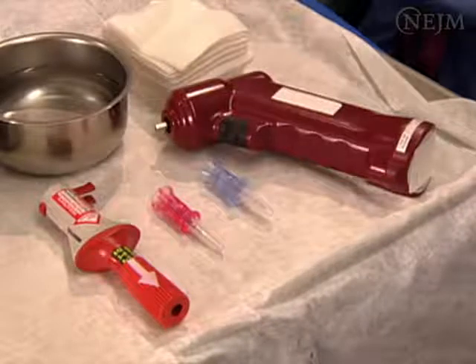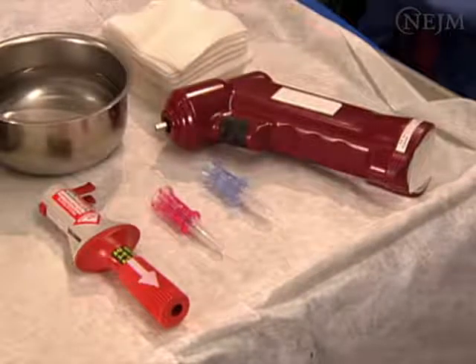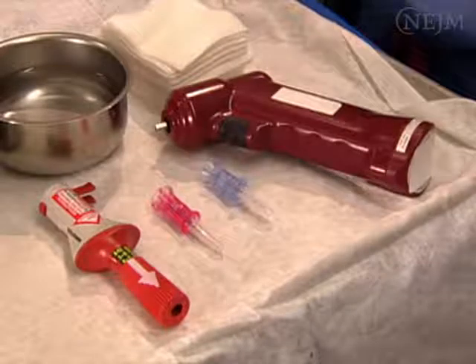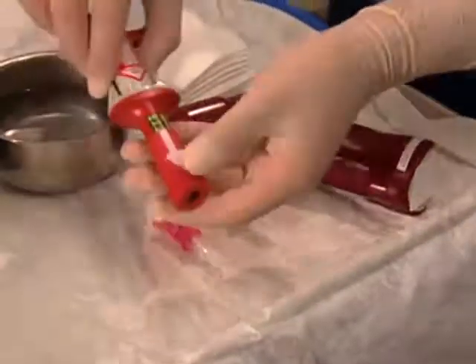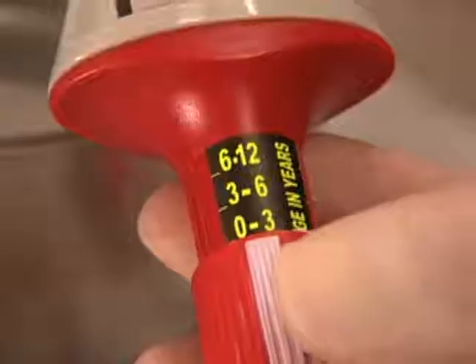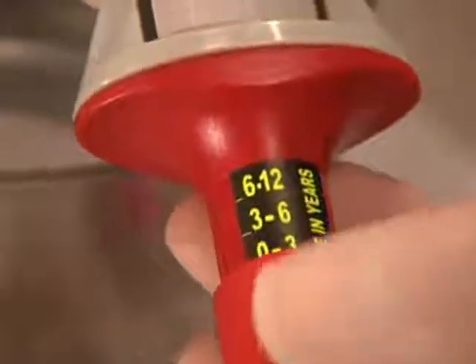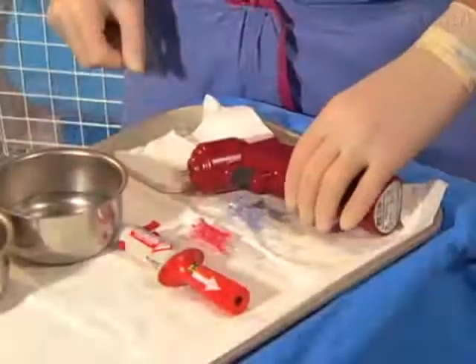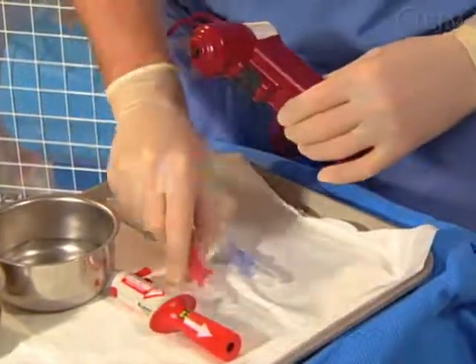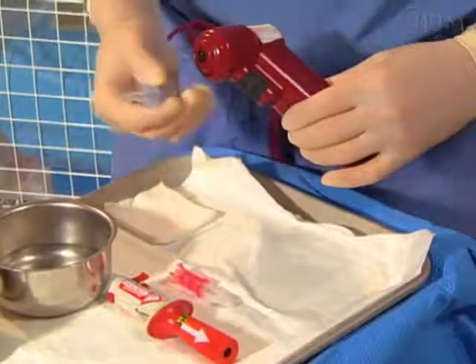Power-assisted devices have been shown to improve placement time and success rates for intraosseous cannulation. Currently, 2 such devices are approved for pediatric use. A spring-loaded device allows the single deployment of a needle to a preset depth of insertion, which is calculated based on the patient's age. A drill-assisted device allows placement of either a pediatric or adult-length needle.